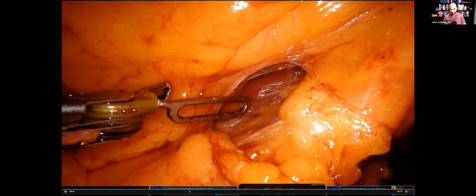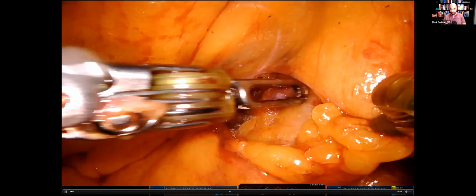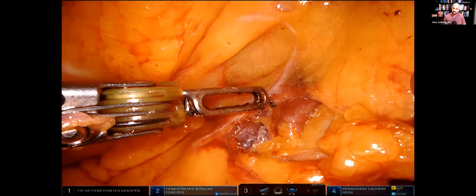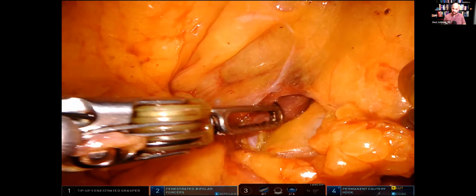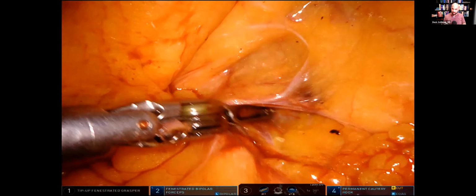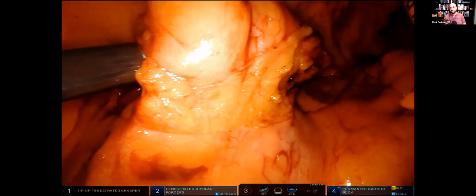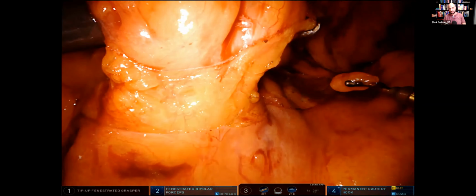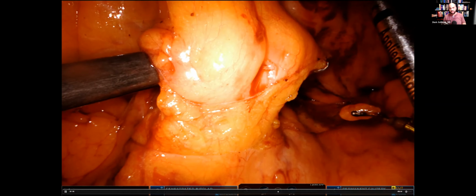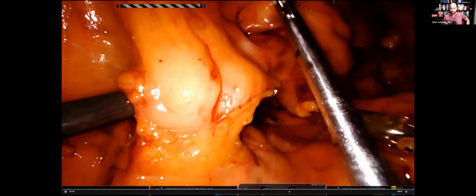Fast forward here. See here in just a second. Hopefully, left ureter comes into view in just a second here. Coming into view, right. You can clearly see I'm off plane there. Let's go gonadal. And now we're going above it there. So now we're just going to work to skinny these two down, thin all this IMA pedicle out so I don't do what we just saw in that previous video.